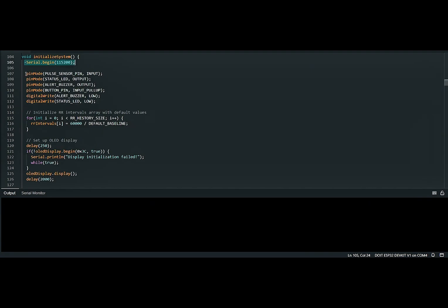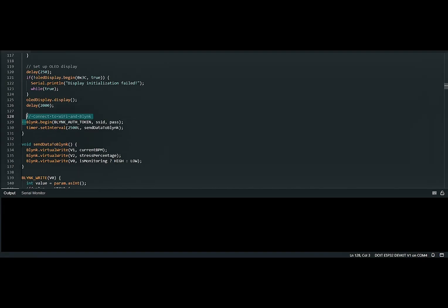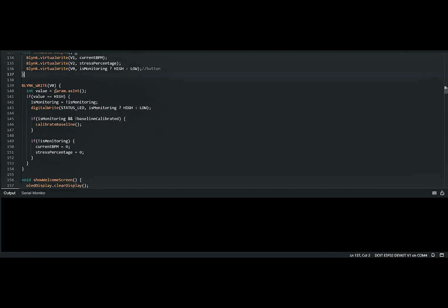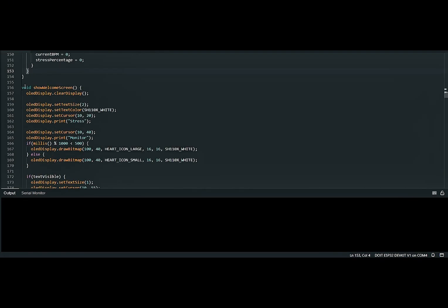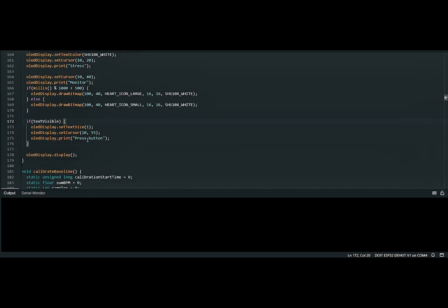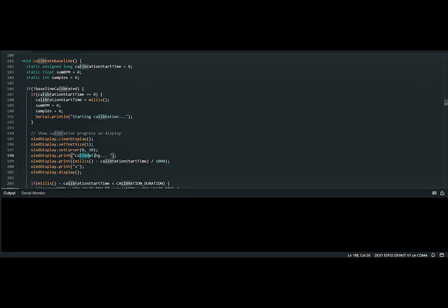So I set the serial begin, pin mode, set data to low, and some initialize variables and system of the OLED and Blynk. Next part is void send data to Blynk. So I use it to send data of the BPM, button and state to Blynk. Next part is the blink light for the button to low and high to start the device. Next part is void show welcome screen. So the welcome screen for the stress monitor. I use the words stress monitor, the blinking heart, and blinking text for the words that say press button.